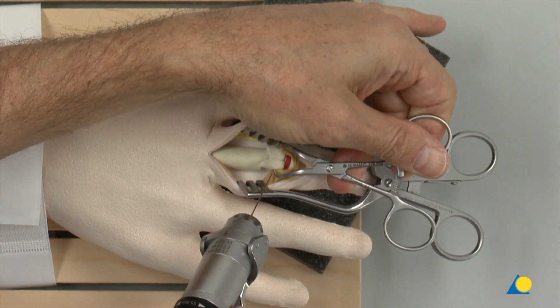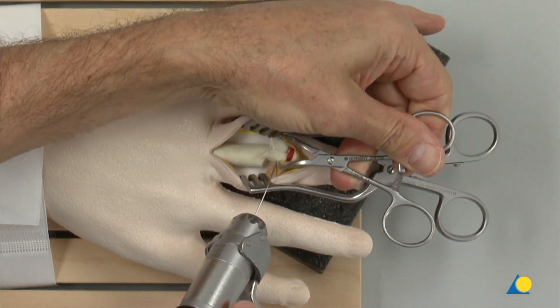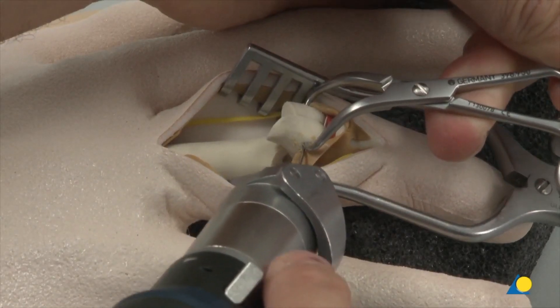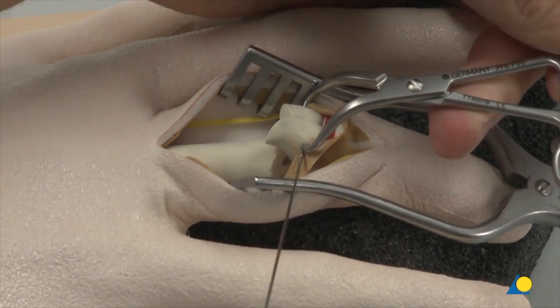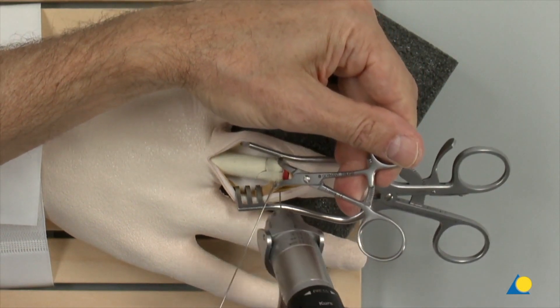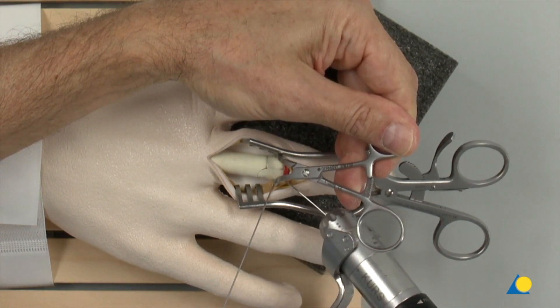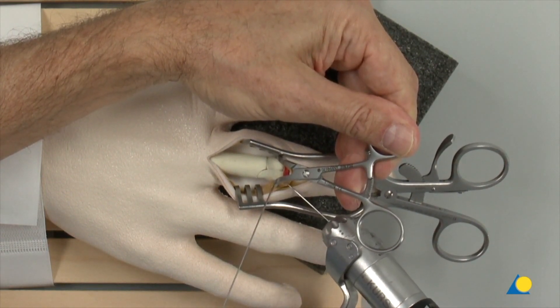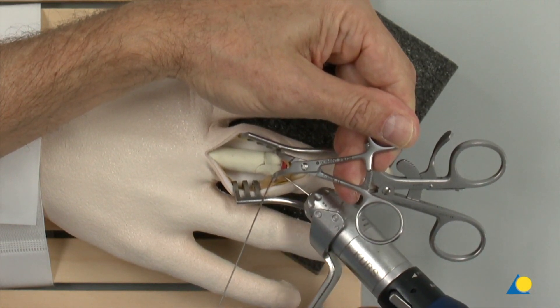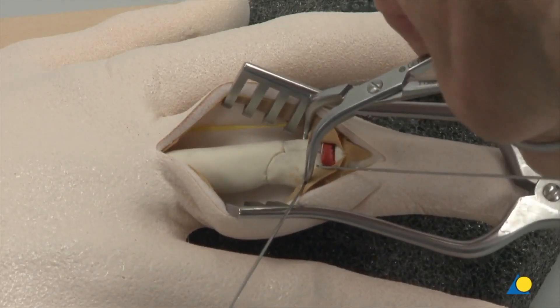The head fragments are correctly reduced to the shaft fragment and secured with two K-wires. The K-wires must not interfere with the plate, which will be positioned later. The reduction forceps is then removed.